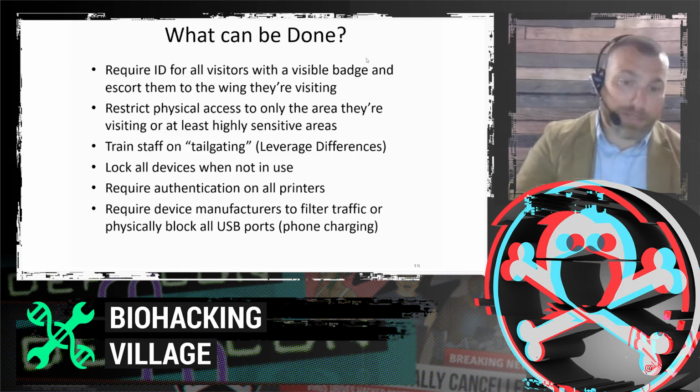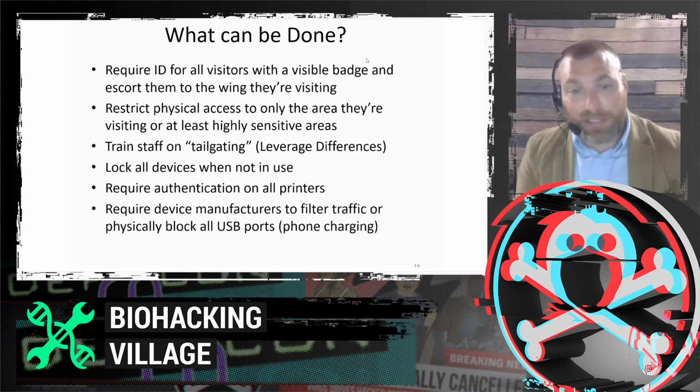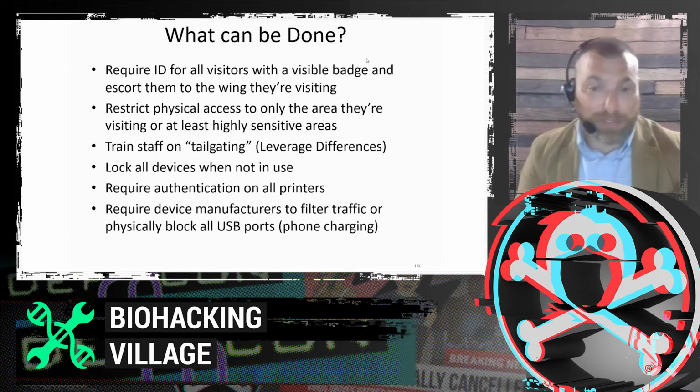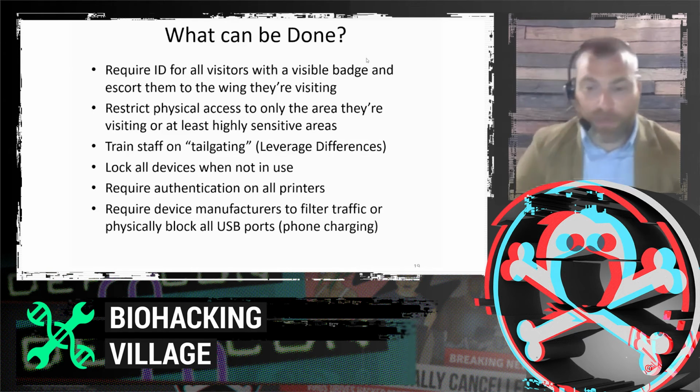And either ask manufacturers to filter traffic, so doing that in your assessments on devices to see if that's an option, or physically block a USB port. Certainly it wouldn't be the first infusion pump plugged into a patient that crashed while it was actually infusing something into the patient because someone plugged in a USB, whether it's something malicious or just a phone charger. If it has a USB port, someone's going to eventually try to charge their phone with it. So just be aware of that.